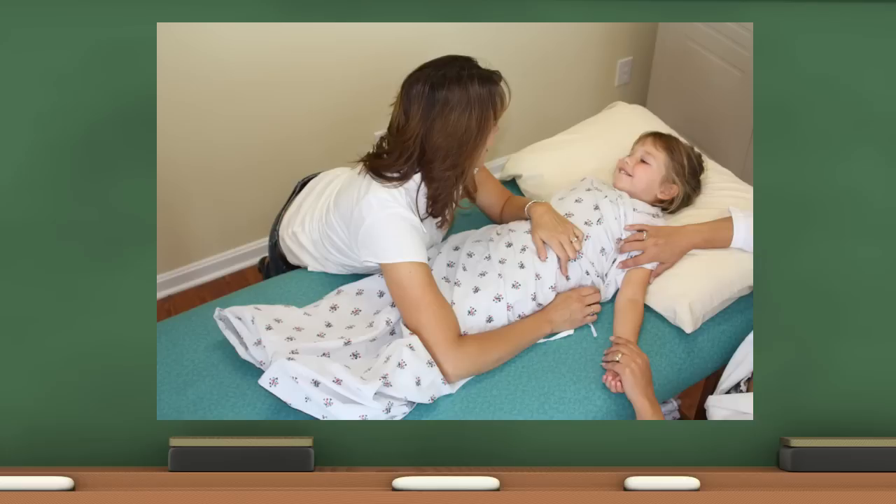Regardless of their position, it's essential on younger children that their arms be immobilized during the puncture to prevent unanticipated reactions. The older the child, the more likely the child will accept the procedure without incident. However, collectors should watch for signs of anxiety and apprehension in all age groups and seek the help of an assistant in holding the patient's arm.